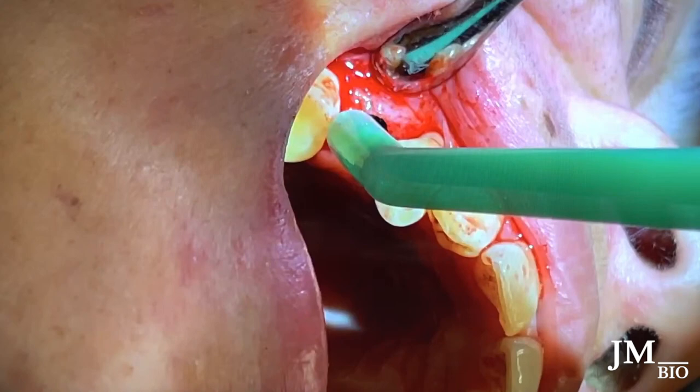And that's closure right there after suturing up — the healing abutment placed and closure. That's what it looks like after healing: a very nice healing. She looks good. She's already been restored — I didn't take a final photo, but that's what it looks like on the x-ray. She's healed up and all done.